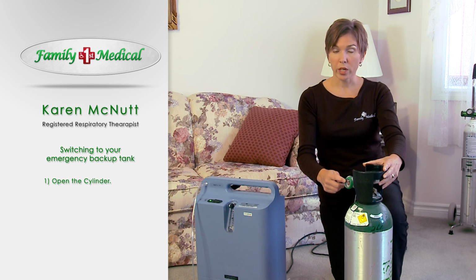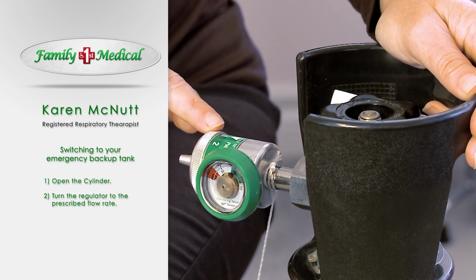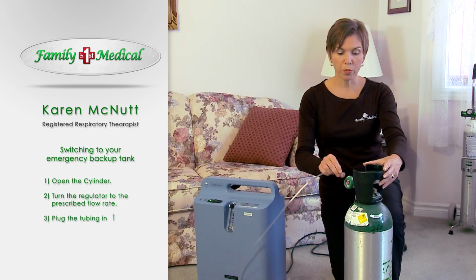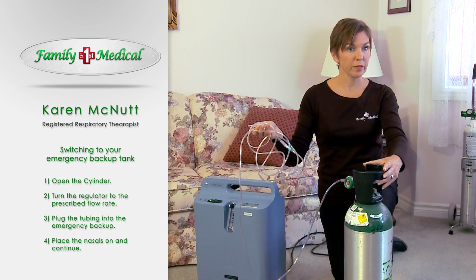Once we've determined the quantity of oxygen in the cylinder, we simply want to turn the regulator to the patient's prescribed flow. Again, in this case, 3 liters per minute. We'll disconnect the tubing from the concentrator and we'll plug it in to the emergency backup. The patient can now place the nasals on and continue.